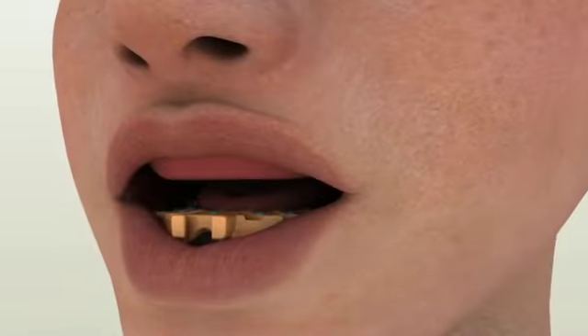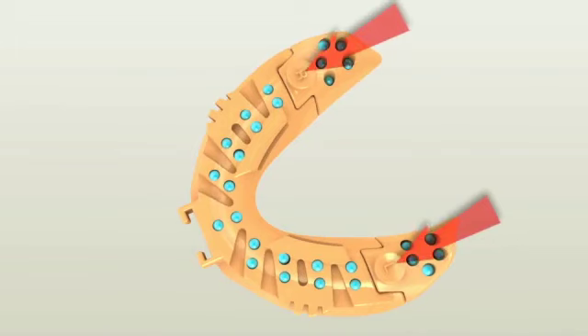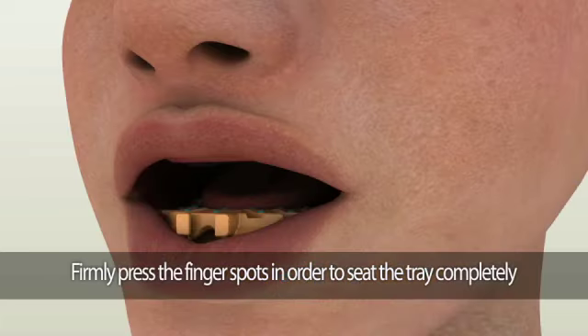Carefully insert the tray into the patient's mouth. To help with the complete seating of the customized Pala digital denture tray, there will be finger spots on the back of the tray. Firmly press the finger spots at the back of the tray to take the final impression. Once the tray is seated, perform border molding procedures.